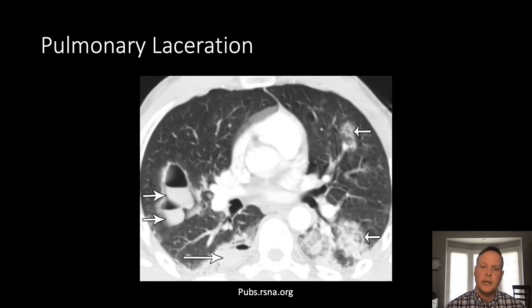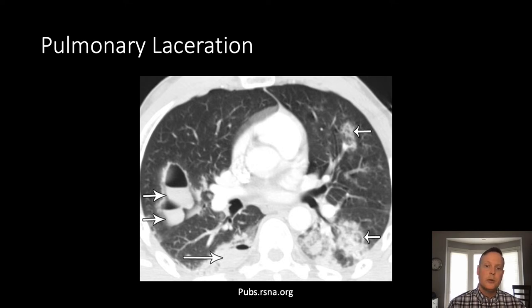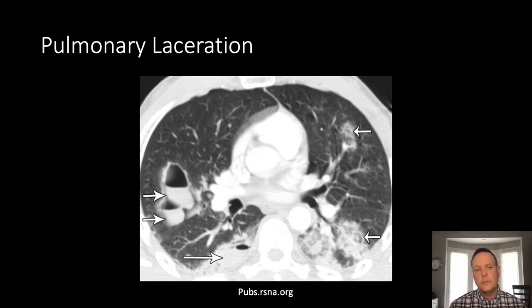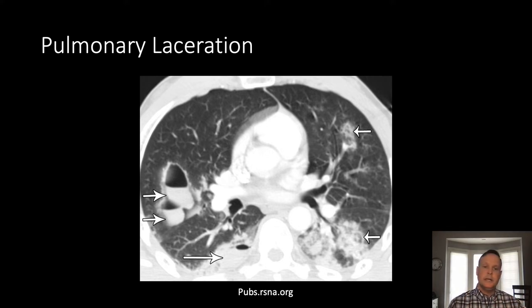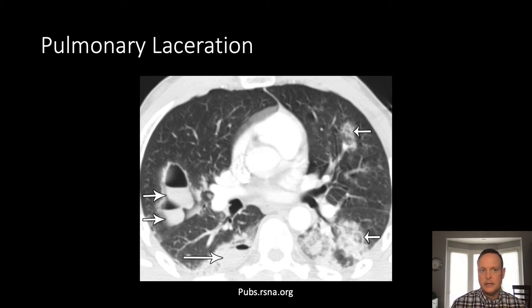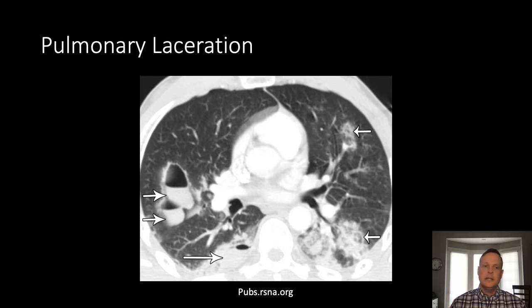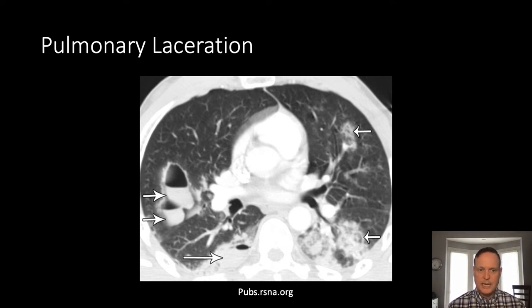Laceration, on the other hand, will cause discontinuity in the pulmonary parenchyma, which opens it up and creates cystic spaces that are generally air and fluid filled. This is a nice example because it shows the associated consolidations typically seen with pulmonary laceration — you've got the contusions as consolidation and then these multifocal cystic areas from pulmonary laceration.